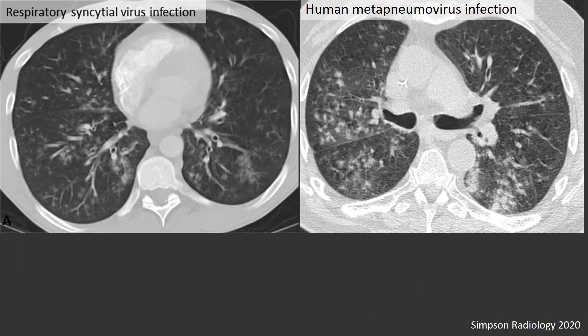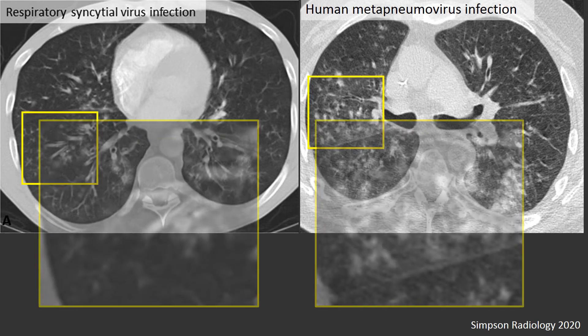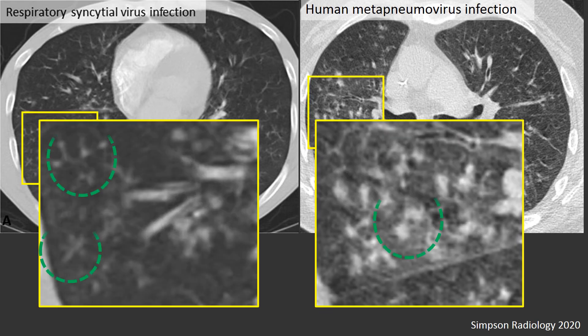Two cases of viral pneumonia — RSV on the left and human metapneumovirus on the right — demonstrate a bronchiolytic pattern within the lung parenchyma, characterized by tree-in-bud opacities and centrilobular nodules. These findings are infrequently reported in COVID-19, though commonly seen in some other viral infections.